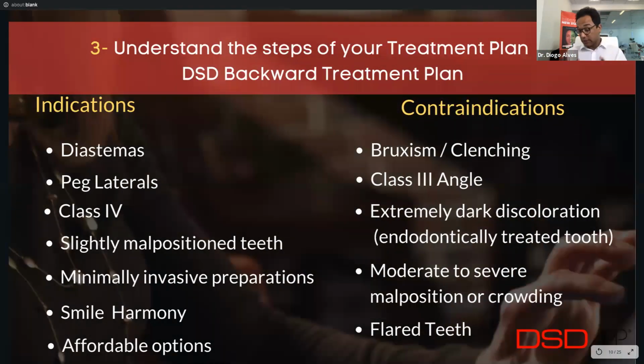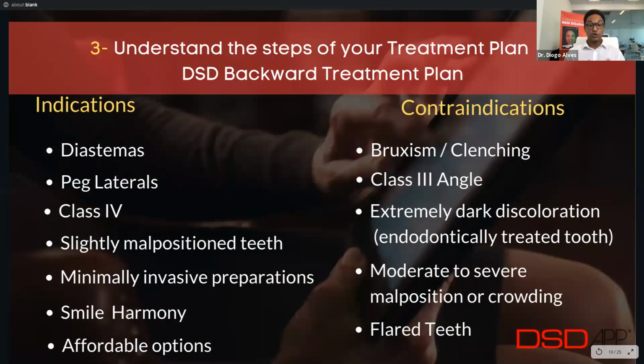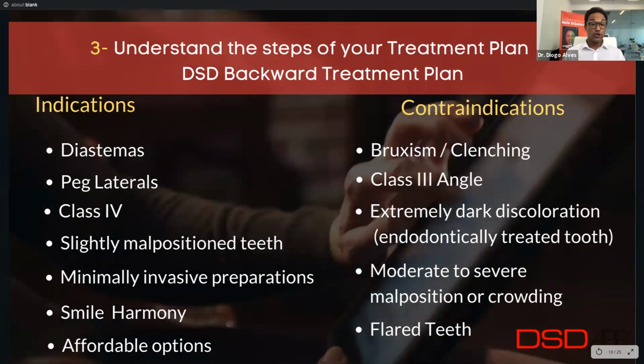And this is extremely important for you to keep in mind whenever you decide to go digital and to use these techniques specifically for your patient.